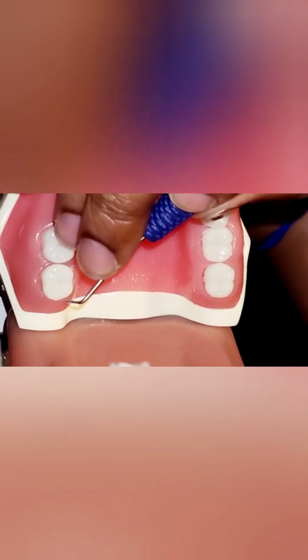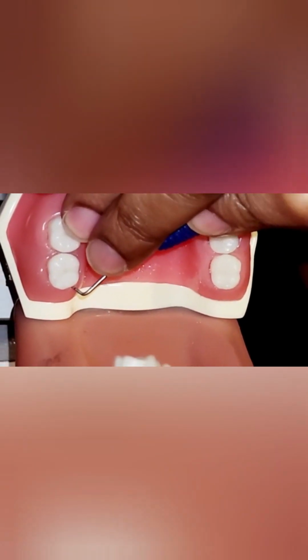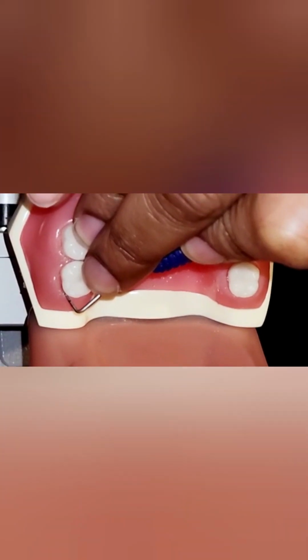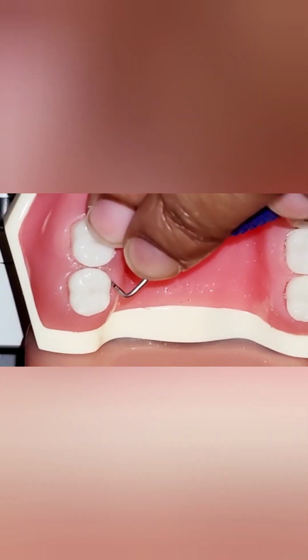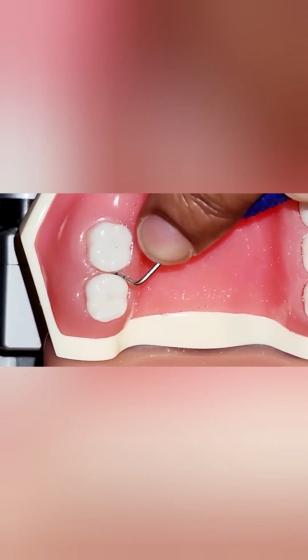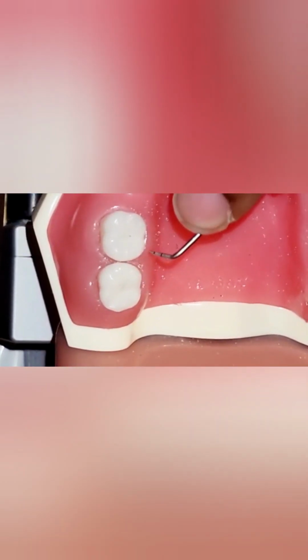Starting from tooth number 16. So we have a 7, walking it back. This is a 7. Nine.